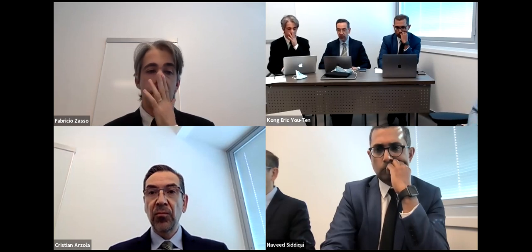Okay, thank you, Dr. Zasso. This is a question from Muniz Abzoudira. It could be from either Dr. Siddiqui or Dr. Zasso. How can you diagnose endobronchial intubation? Is it by lung or airway ultrasound? I would say that the better approach would be lung ultrasound, right? You agree? Yes.